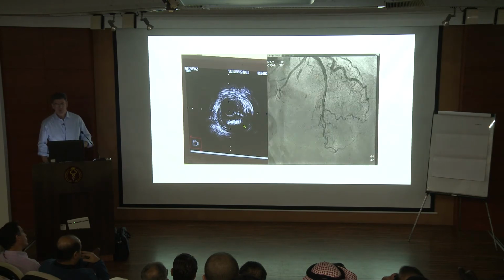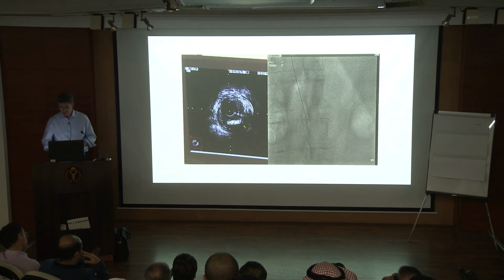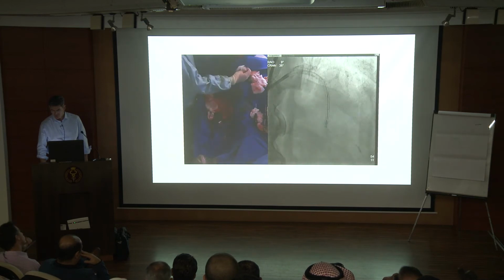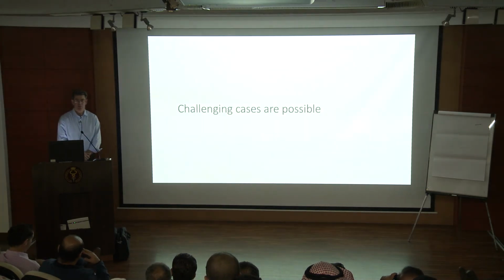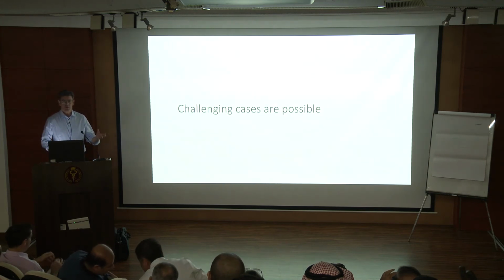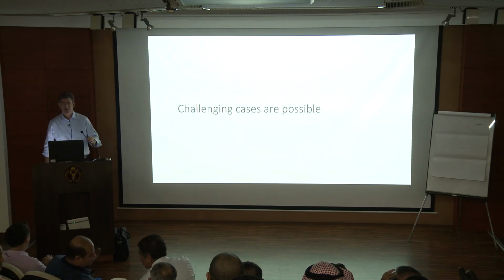So once the wire's in, typical sort of changeover, and the revascularization happens then in the conventional fashion. So in this case, very nice stent placement here in a relatively simple primary ADR case. But as we saw from the case yesterday, which wasn't quite as simple as this case we've seen, it is possible to use and effectively deploy ADR and Stingray in much more challenging cases.